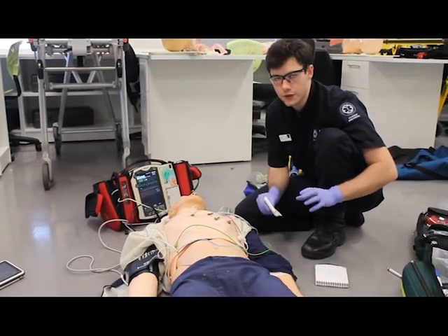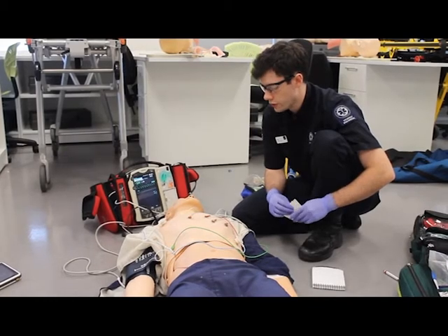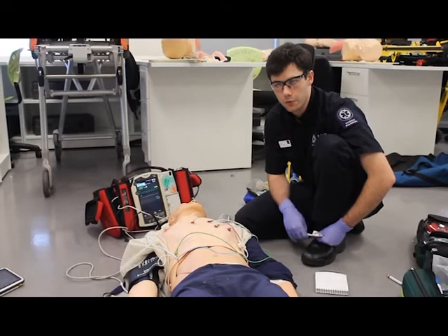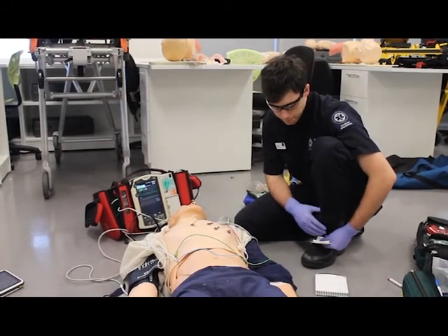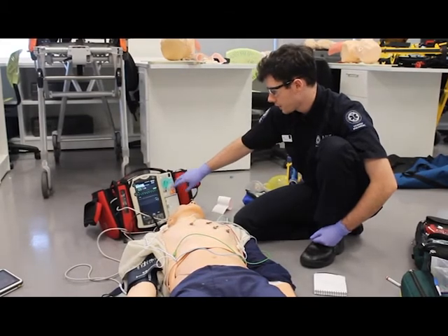Cardioversion is a painful and invasive procedure. So if Bob was conscious, if Bob could obey commands, we'd be providing adequate analgesia for Bob. We'd likely use ketamine in this example. Next, we're going to charge our defibrillator to maximum joules.